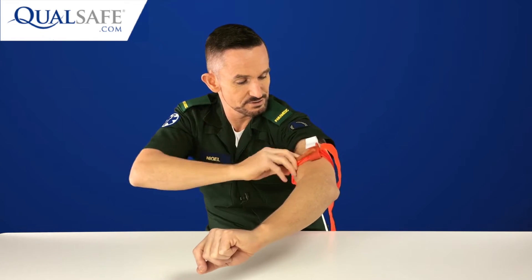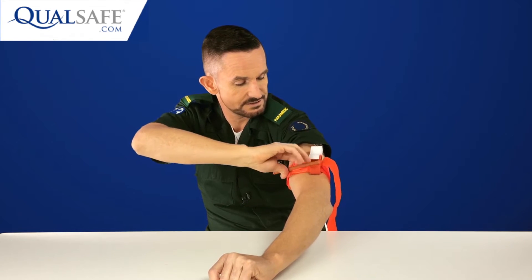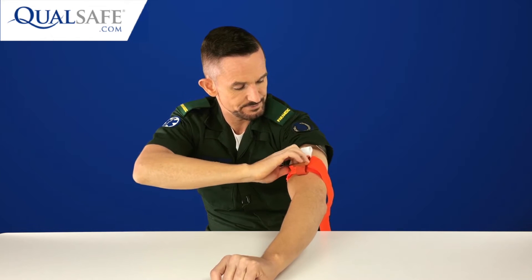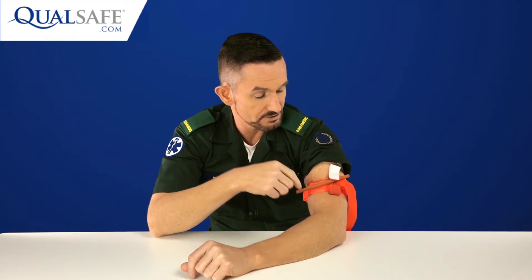Then give it a little twist — this is the windlass. You twist and twist to tighten it up. I've applied this to myself here. In the classroom setting, we don't want students applying tourniquets either to themselves or to other people — there's a section on how to safely apply and teach tourniquets in the classroom, so watch that before you go live.